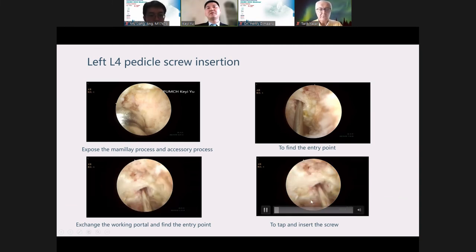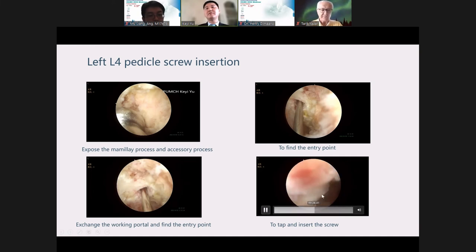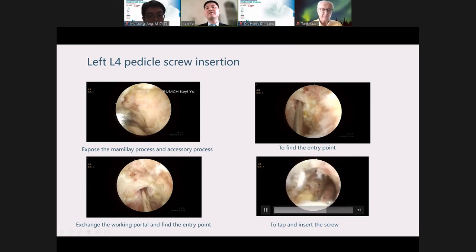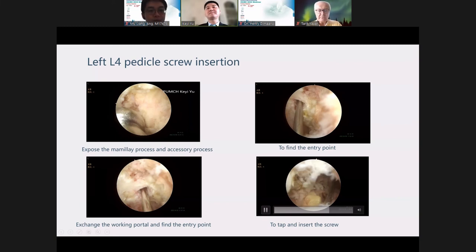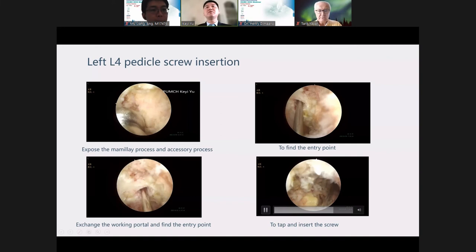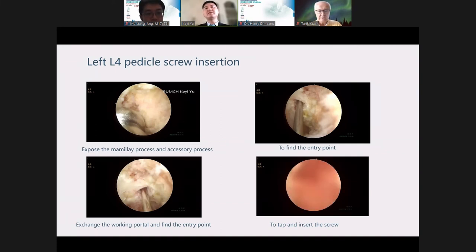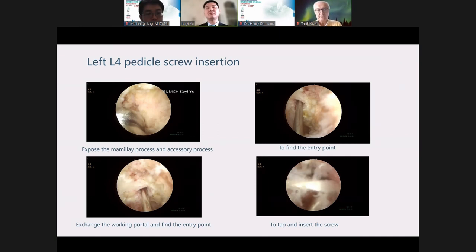I will make the X-ray check. If the position is good, I use the probe to make the canal for screw insertion. Now you can see very clearly — 25 mm, 30, 40 — that's enough. After using the probe, you can feel the medial wall, inner wall, and lower wall of the canal to make sure there is a good position with no breach of the screw trajectory.